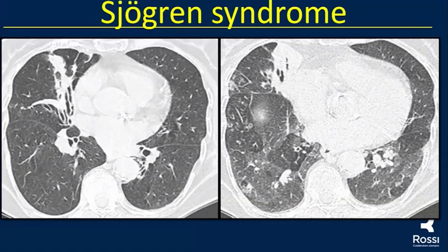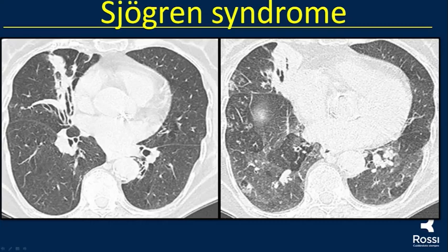In patients with Sjogren's, we can also see bronchial disease. We see bronchiectasis in the middle lung with some distortion and traction bronchiectasis. The expiratory CT shows normal lung and small areas of air trapping. We can also see airway bronchial thickening in both lungs.